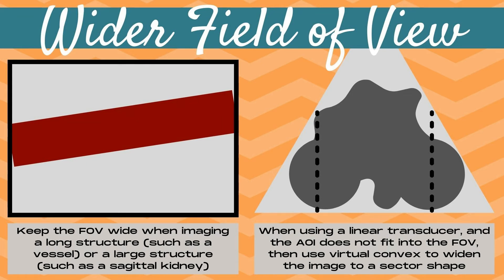When would you use the field of view or width ultrasound control? First, let's learn when you should widen the field of view. When using either a linear probe or a curvilinear probe, you want to keep the field of view as wide as possible when imaging a long structure such as a vessel. When imaging a vessel such as the sagittal aorta, it's okay for the sides of the vessel to be cut off outside the field of view as long as the vessel is as elongated as possible. You can also widen the FOV when imaging a large structure such as a sagittal kidney, ensuring both edges of the kidney are visible with a strip of normal tissue on both sides.